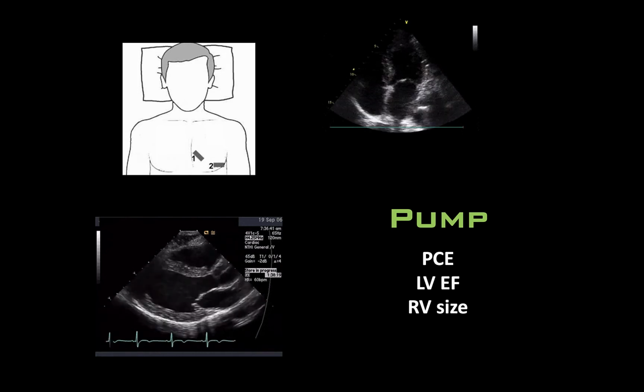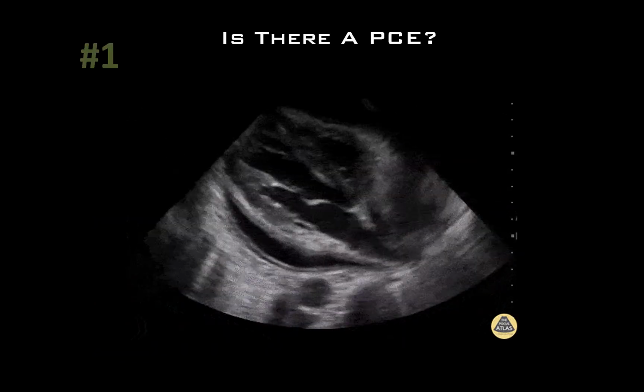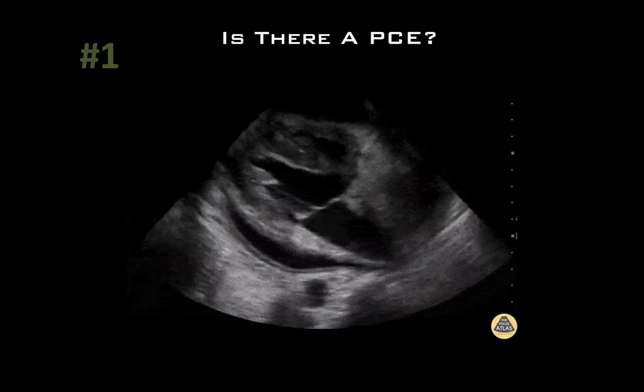And third, is there any evidence of RV enlargement that may be suggestive of acute pulmonary hypertension? Let's start by addressing the first question. This is an example of a parasternal long axis view demonstrating a pericardial effusion.